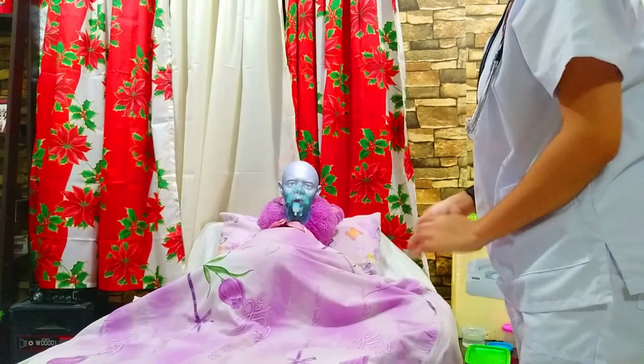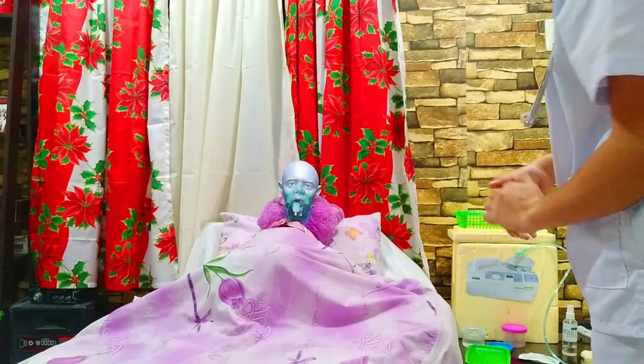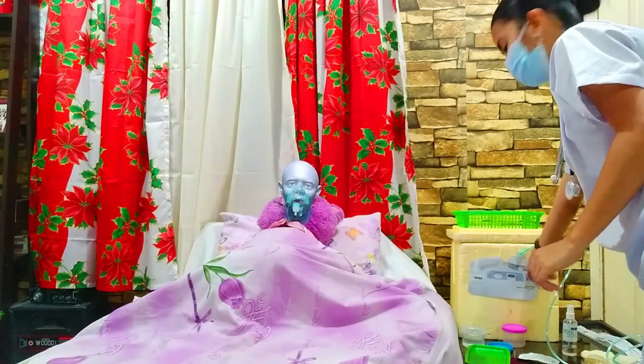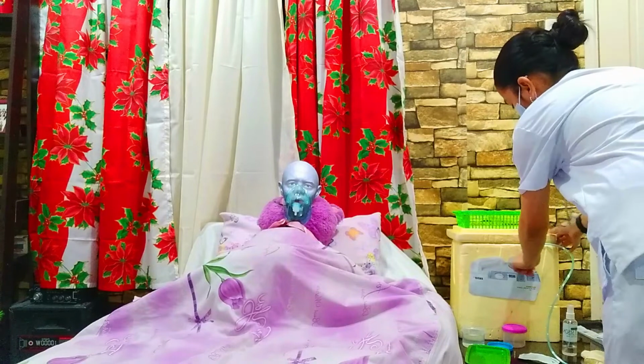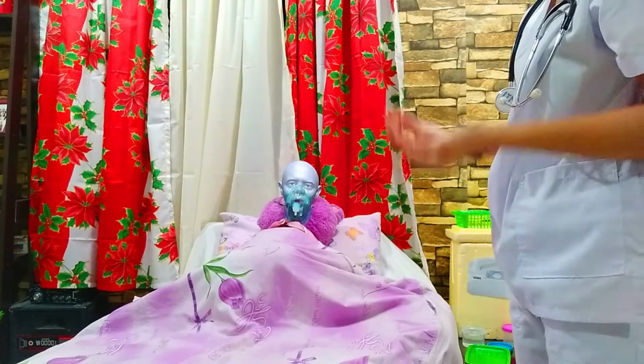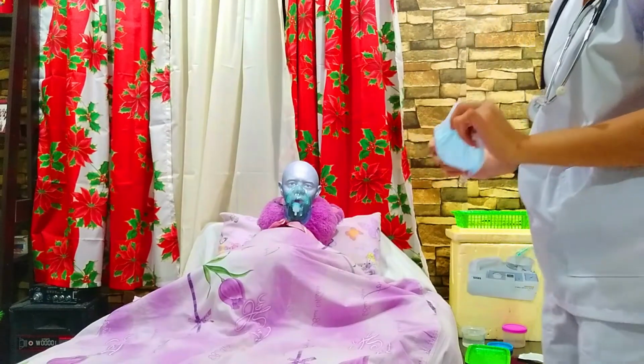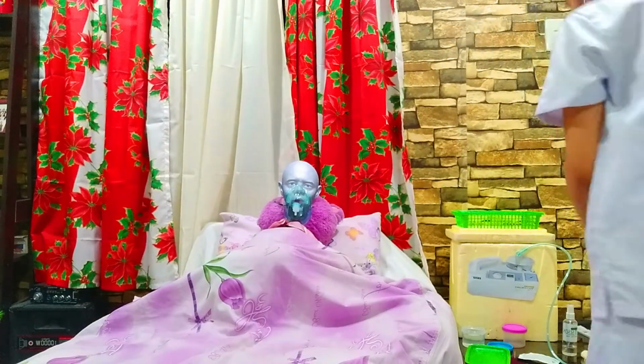And then turn off the suction and remove the supplemental oxygen placed for suctioning if appropriate. And then we need to remove the face shield or goggles and face mask and perform hand hygiene.